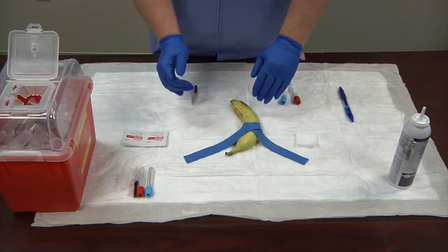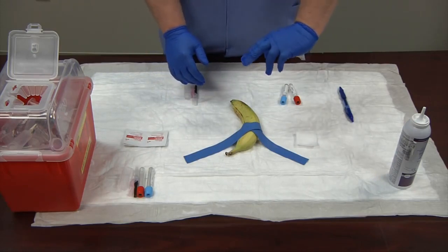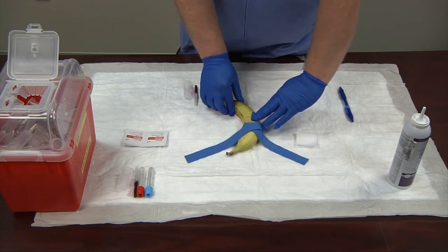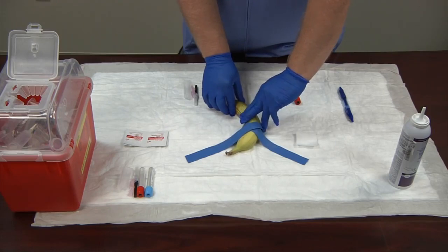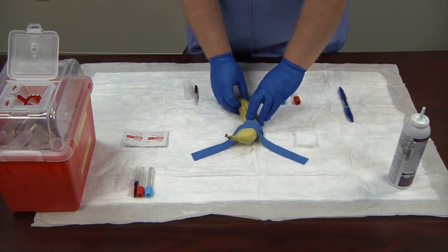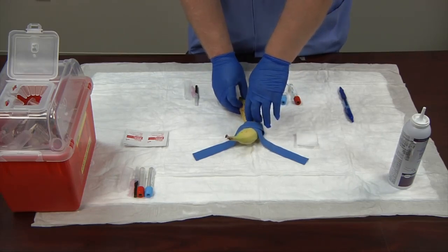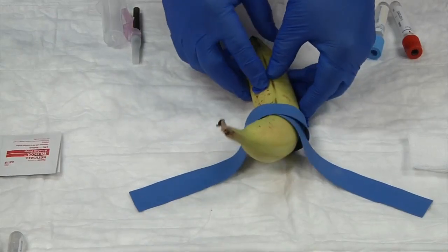I have my tourniquet on and now I begin to palpate. As we palpate, we use our two non-dominant index fingers and go over one side, feeling across, picking the vein we'd like to use. We'll go right here. I'm going to do a landmark — you can use body skin features like freckles or small pimples, or press gently with your thumbnail to make a small mark. I've found my landmark.